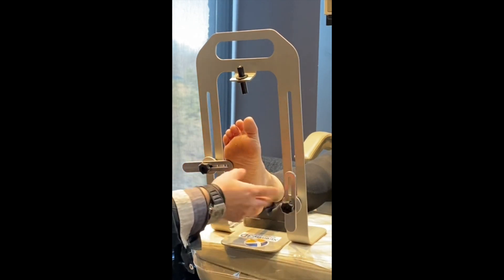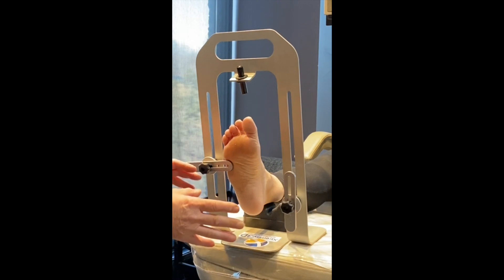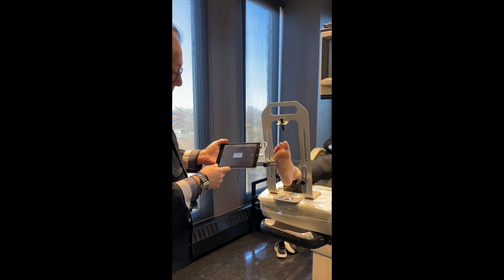Then we switch to the other foot and there's another bar to hold everything in place. It makes it more comfortable for the patient because they don't have to try and keep their foot in neutral position and keep it steady. This works quite well. Typically, scanners for prescription orthotics have been very bulky units, but what we use is a mini iPad.